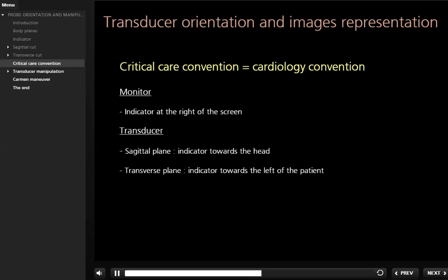This convention is easy to remember. The indicator on the monitor is always positioned at the right of the screen. In sagittal plane, transducer indicator is pointed towards the head. In transverse plane, transducer indicator is directed towards the left of the patient.